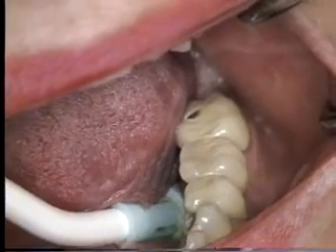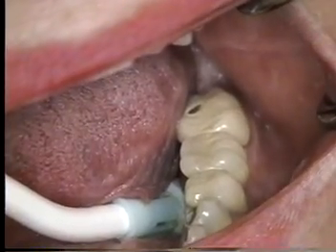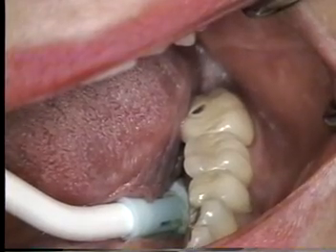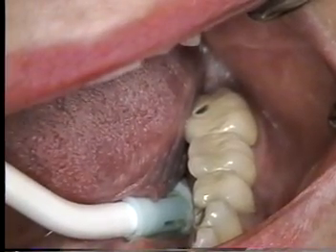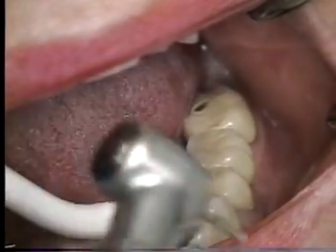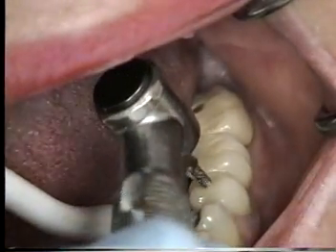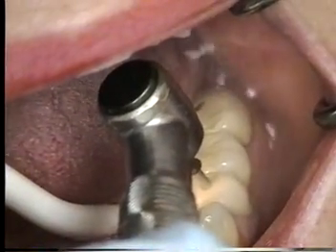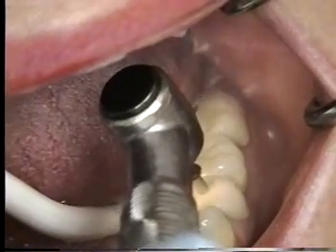On this fixed bridge, the first thing I have to do is go through the porcelain so I can gain access to the metal. That's why we call it a metal lift — because we need metal to actually remove the bridge. I'm going to take the porcelain off first to get to the metal, going in with a cylindrical diamond to open the porcelain slightly.